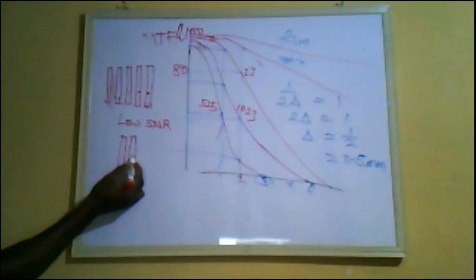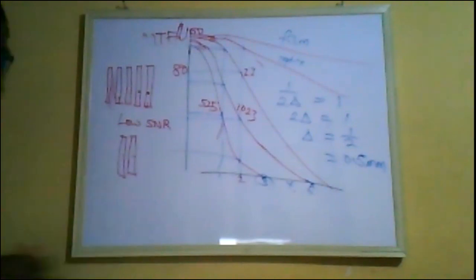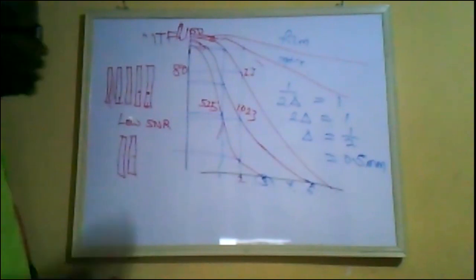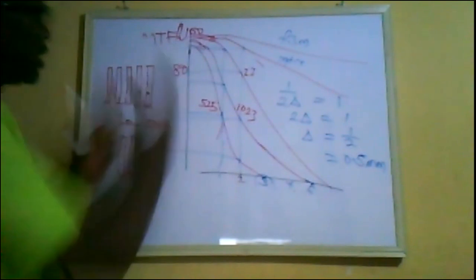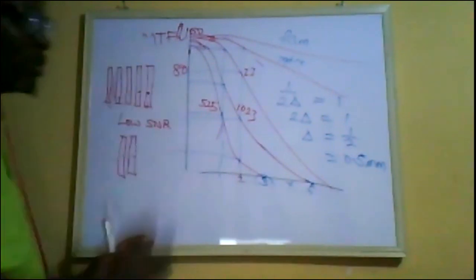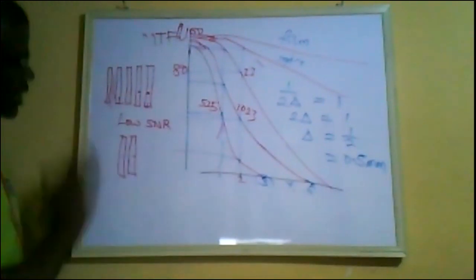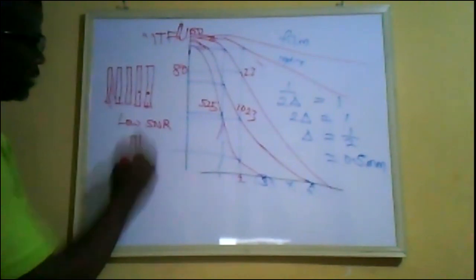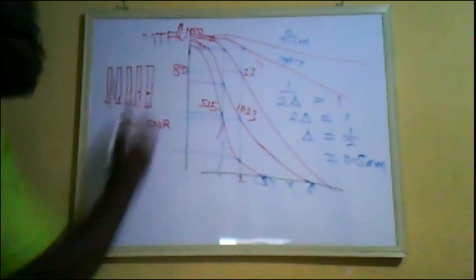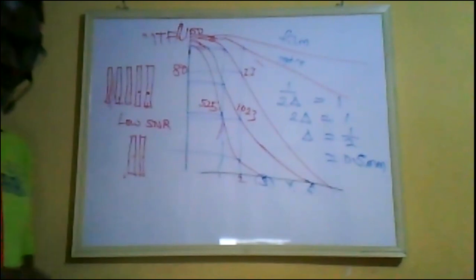So at the end of the day, you're going to have a kind of lag because we're actually looking at a motion picture. Something is done in real time on the computer. It uses 3 frames, averages the 3 frames, and gives the image on the monitor. You can average 10 frames and give the image on the monitor. As the motion appears, the next frame that appears is again an average of so many frames that have been used. So you're going to be causing a kind of lag on the picture.